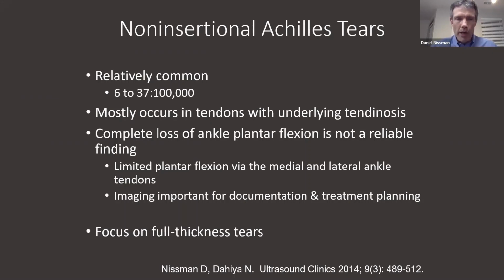Now, the reason that we want to think about imaging is that complete loss of ankle plantar flexion is not a reliable finding for a full thickness tear. In fact, you can still get some limited plantar flexion with intact medial and lateral ankle tendons. So imaging is important for documentation and treatment planning. We're going to focus on full thickness tears here.